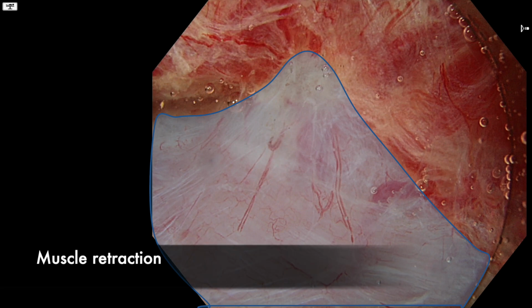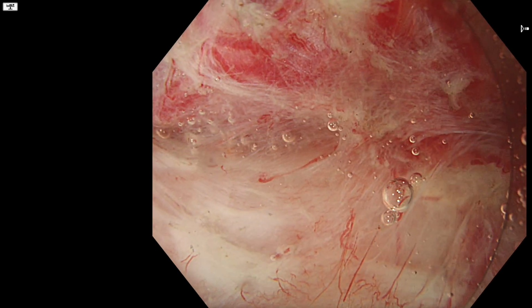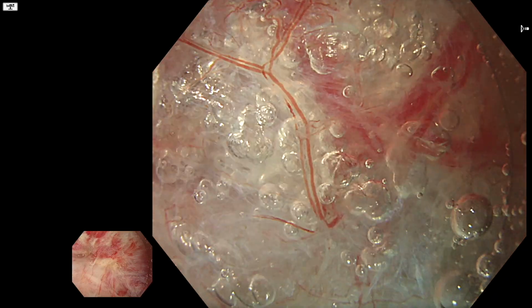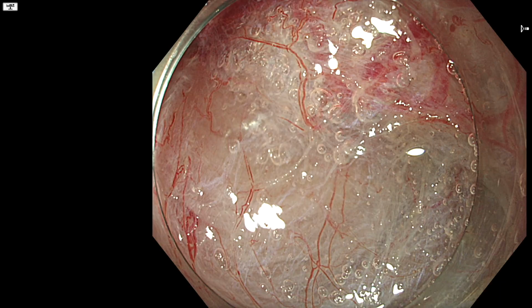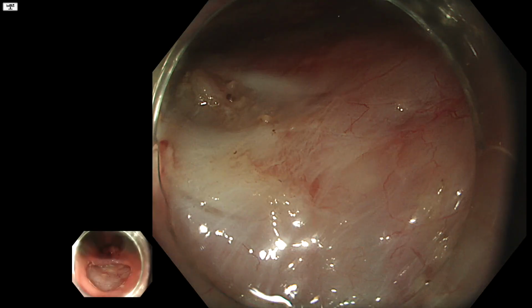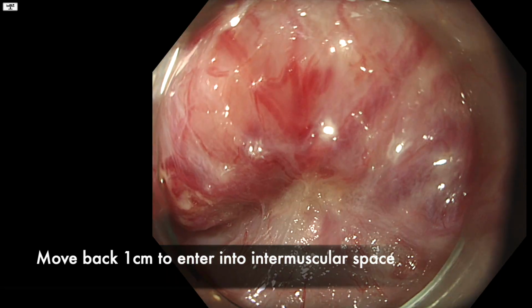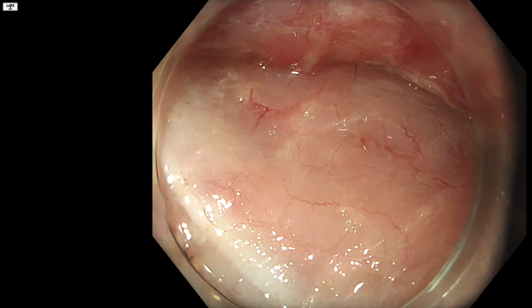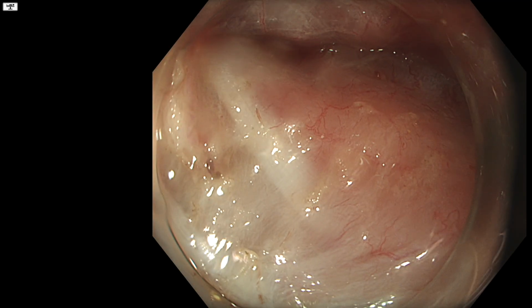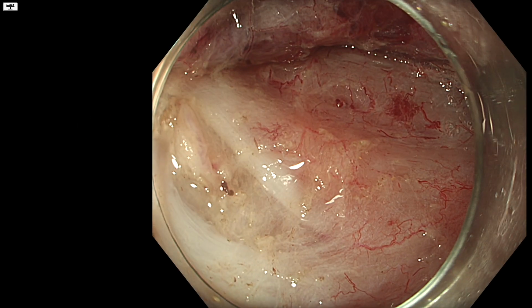You can clearly see the muscle retraction here now. At this point, there's still some submucosa on the sides, but there's not much benefit in dissecting any further here now that we're committed to the intermuscular plane. So what we do is position ourselves directly under the lesion, then withdraw approximately 1 centimeter from here, and from that position we look for a natural opening between the circular muscle fibers and inject into that space to begin our intermuscular dissection.